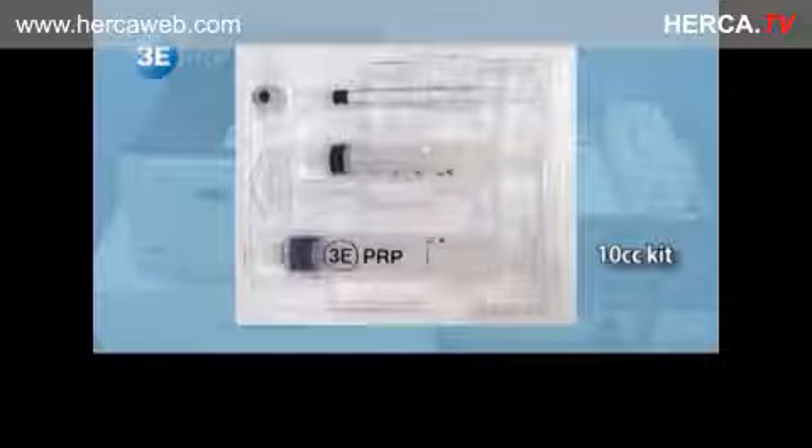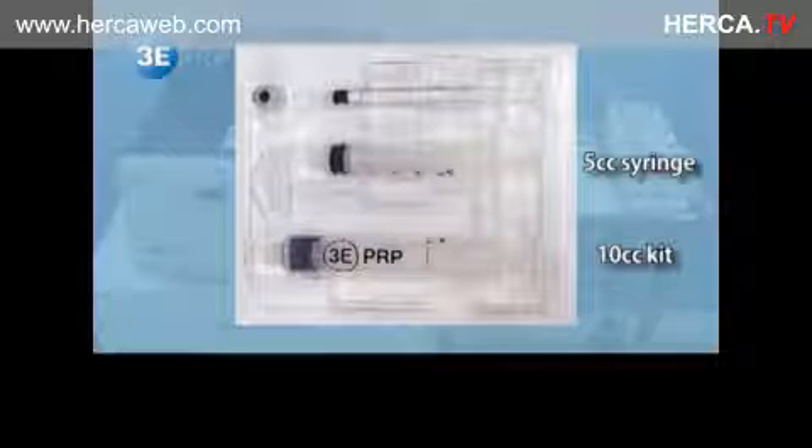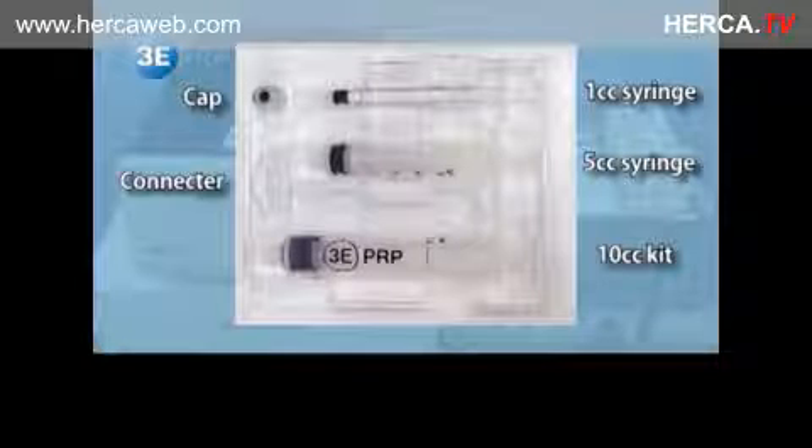The EEE PRP 10cc kit consists of a 10cc kit, 5cc and 1cc syringes, a cap, and a connector.